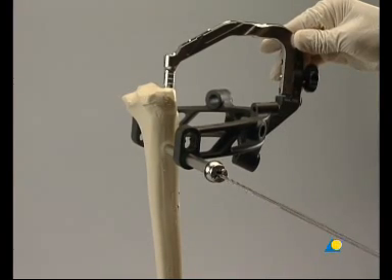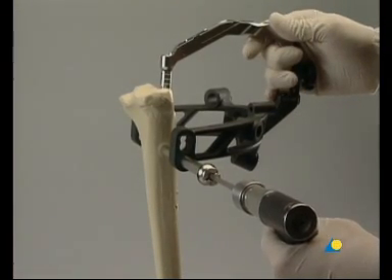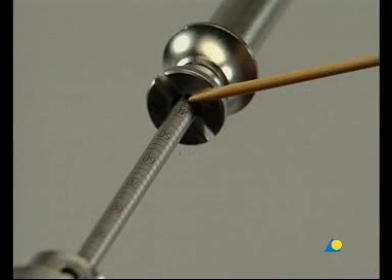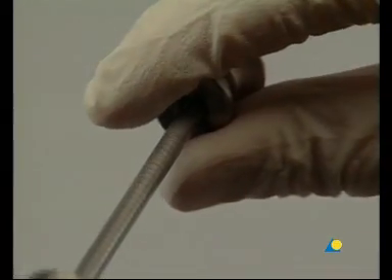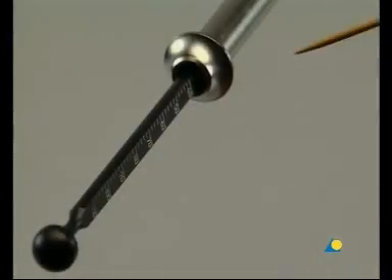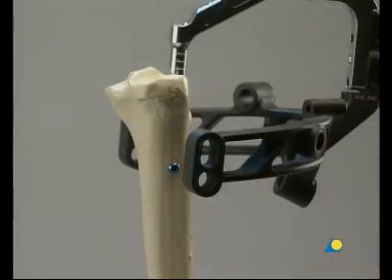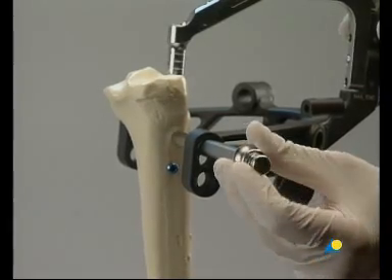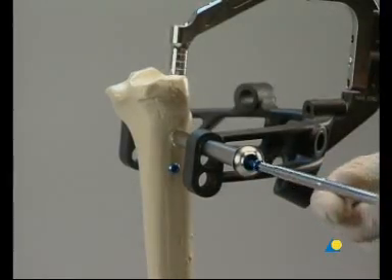Using the corresponding drill bit, both cortices are drilled until the tip of the drill bit just breaks through the far cortex. The drill sleeve is pressed firmly against the near cortex, and the measurement is read from the calibrated drill bit. This measurement corresponds to the appropriate length of the locking screw. As an alternative, the length of the screw can be read from the depth gauge for locking screws. A locking screw is inserted with the star drive screwdriver through the protection sleeve, until the head of the locking screw lies against the near cortex. The tip of the locking screw should not project more than two millimeters beyond the far cortex. These steps are repeated for the second locking screw.